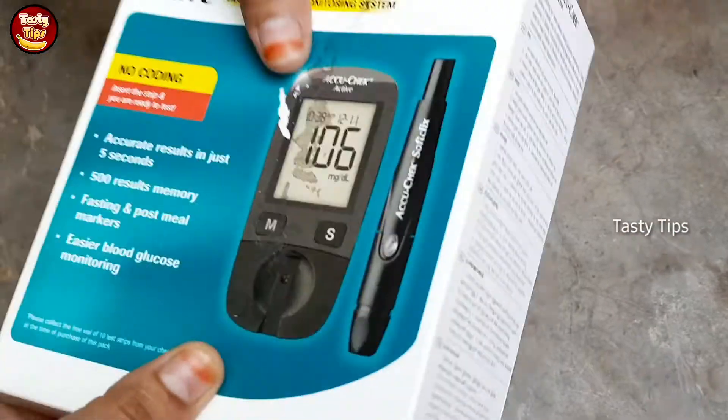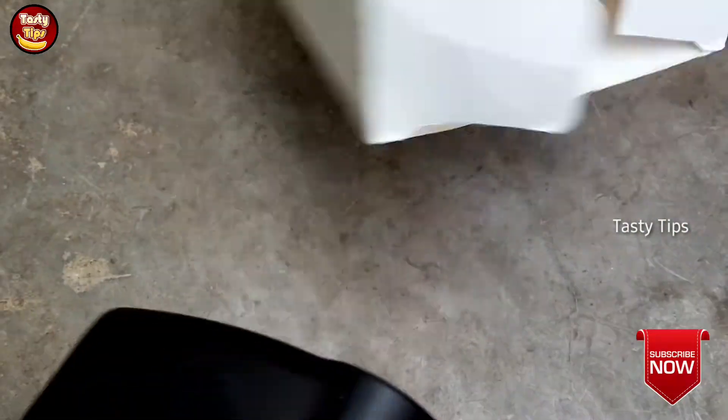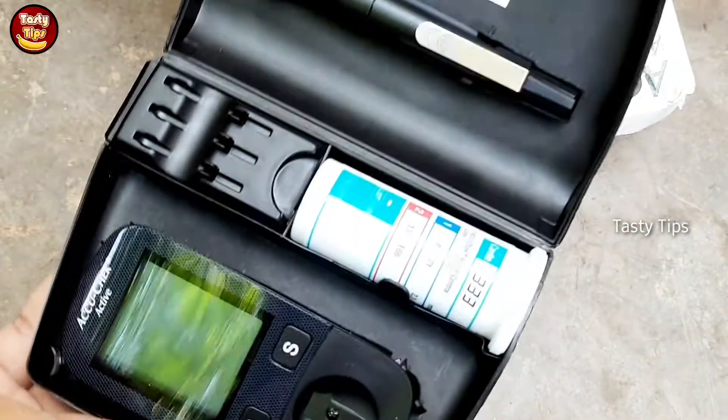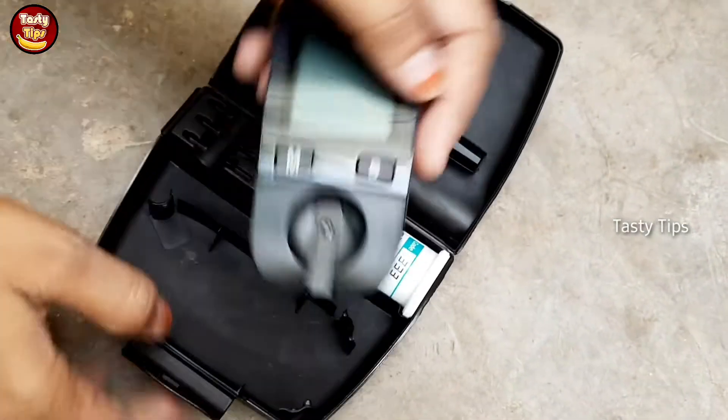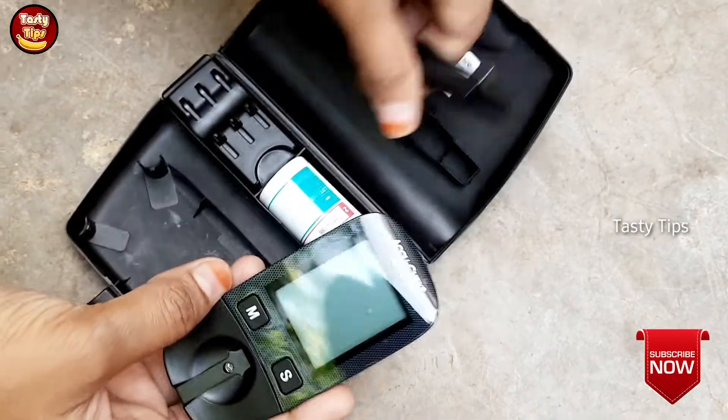What I am going to do is — this is a very useful product. I am going to check this box. This is the sugar level. This is the pen.